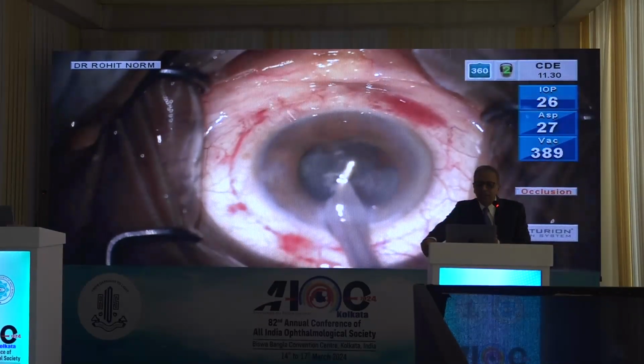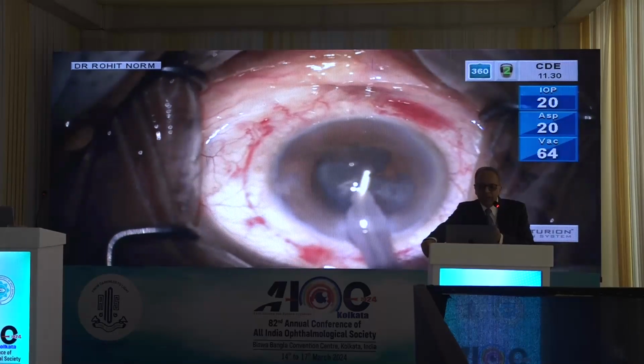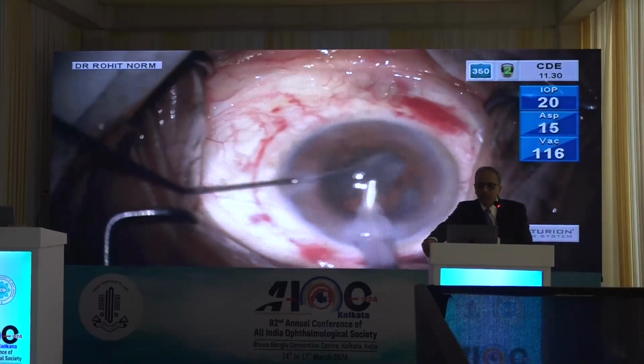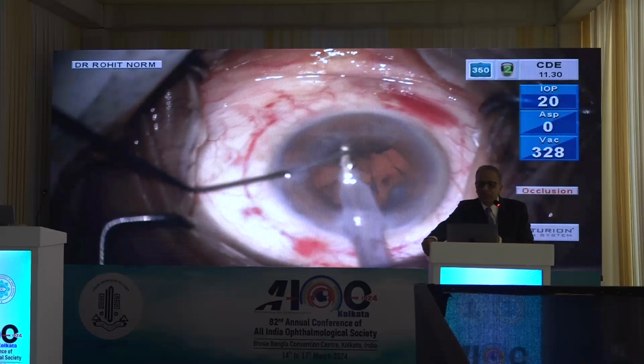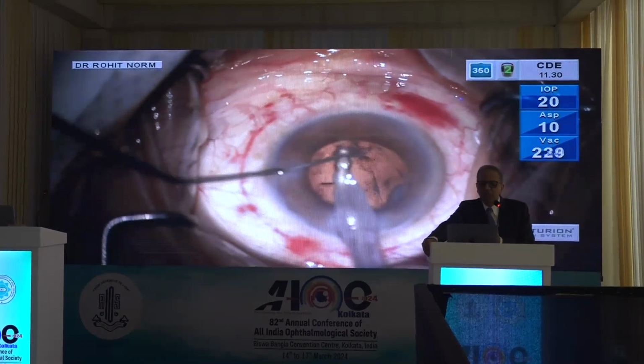Since it is being done, it's difficult at times, so it is going around at a very slow pace. And I'm trying to just stuff it in so that I'm able to do total aspiration of the posterior part of the epinucleus.